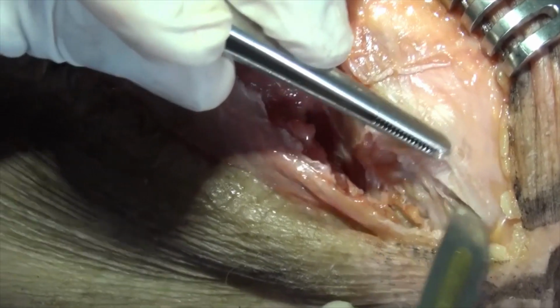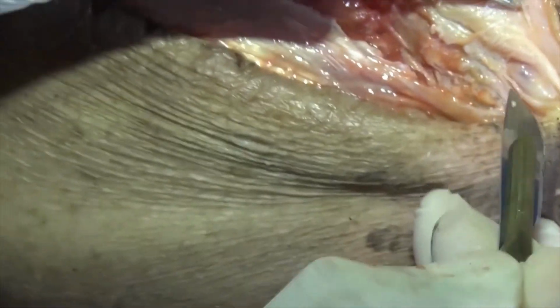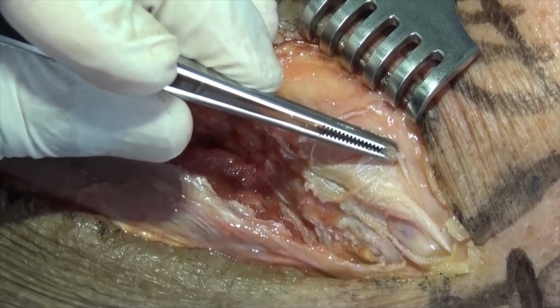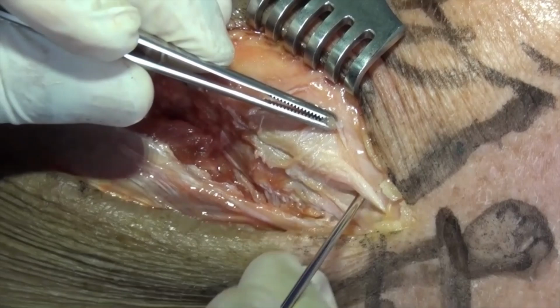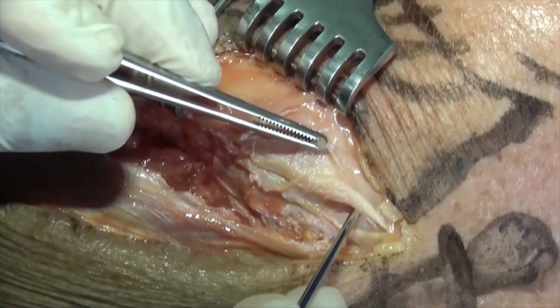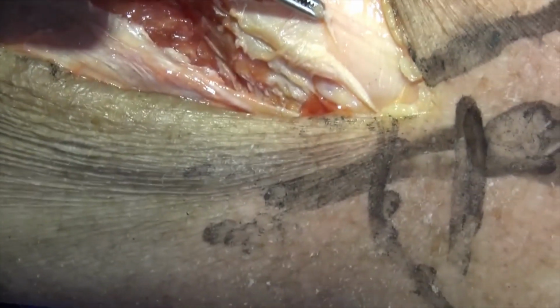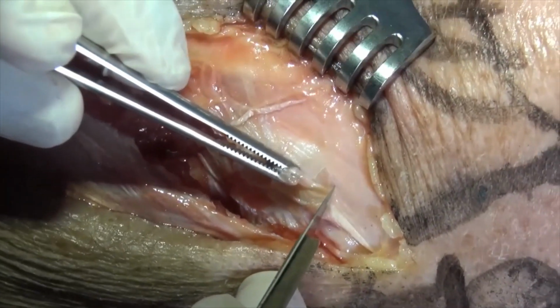Okay, now we make our incision. You can see the bulge. Can you see the bulge of the synovium with its fluid that comes through from here? And again, you can confirm that you are in the joint. You can see the thing disappears. Sorry, this is my joint. Thing is moving, and you can see the joint fluid coming. So having identified that, you can then make your incision.